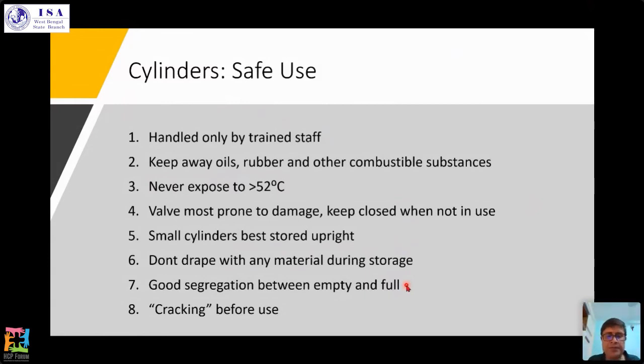So what is cracking? The port of the cylinder is an opening. In spite of covering it up with insulation tape, small dust particles can get into it. If you connect it directly and switch it on, the small dust particles will enter the breathing circuit. There are very delicate parts inside, especially the flow meter tubes, and the dust will be deposited on them and cause problems later. So you gently open the cylinder, with the port pointing away from any person. Let a little bit of gas flow. You tighten the valve again, then connect. So this is cracking, a simple thing.